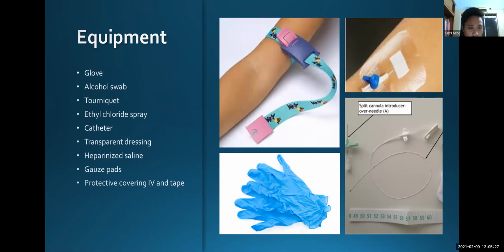And then protective covering for the IV such as a plastic cup and also tape. Okay. I have the video of the presentation.